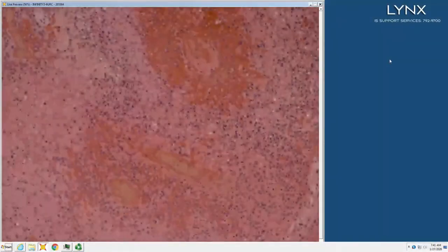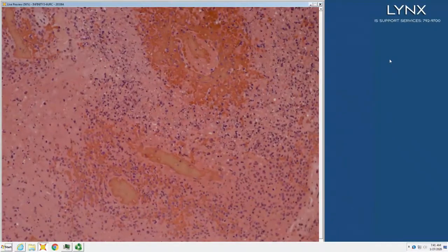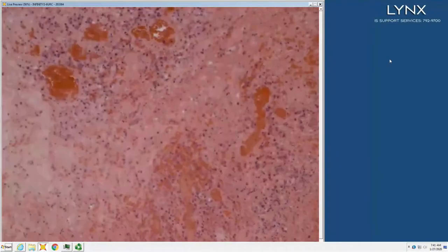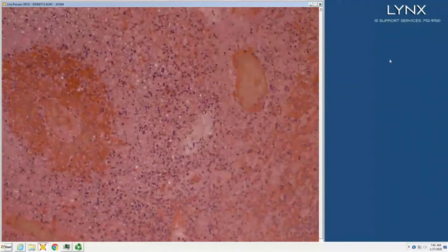And when you look around the dead vessels, even though a lot of the cells are necrotic, you can see there are some big lymphocytes around those vessels. Angiocentric, angiodestructive lymphomas ulcerate and cause tissue necrosis. So the lymphocytes beat on the vessels, destroy the vessels, the lymphoma ulcerates. They can look like pyoderma gangrenosum.